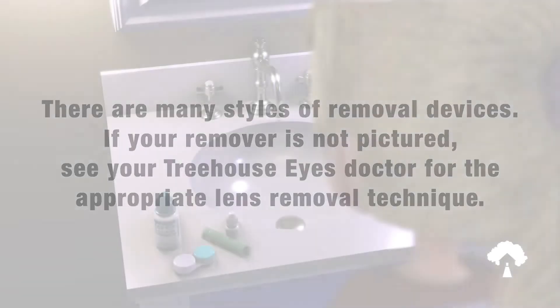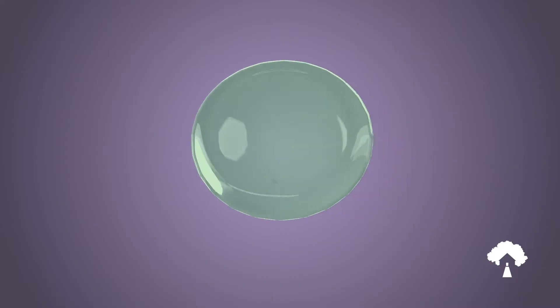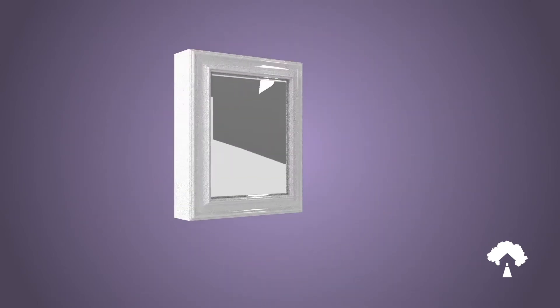Have all supplies ready before beginning the removal process: your lenses, lens case, approved gas permeable care solutions, saline, artificial tears, a lens insertion and removal device if using one, and a mirror.